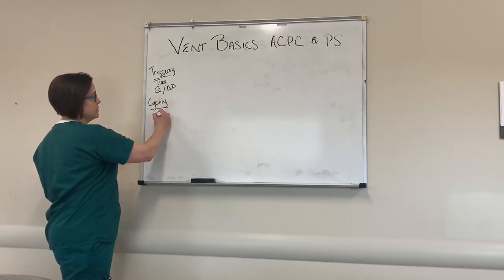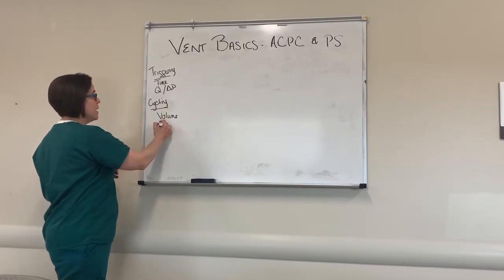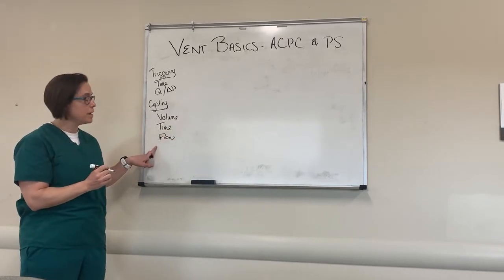So one of those things was volume. That's what we discussed last time. The other two, one was time and one was flow. So we're going to talk about these today, okay?